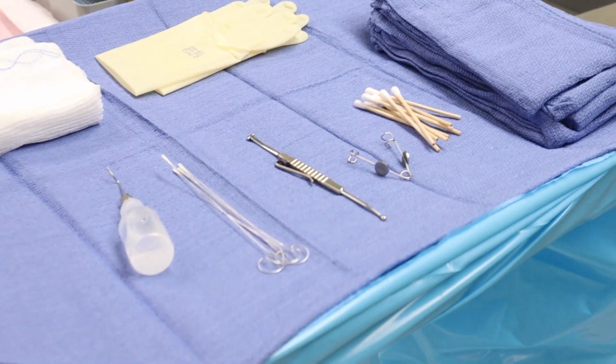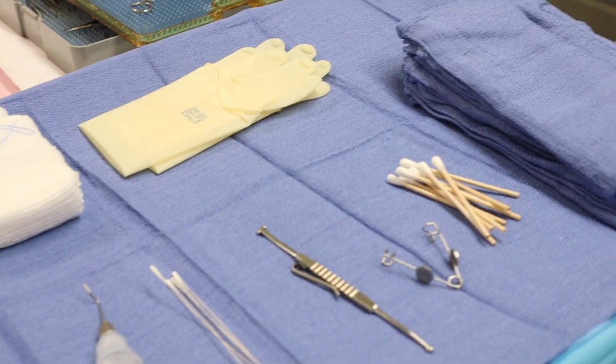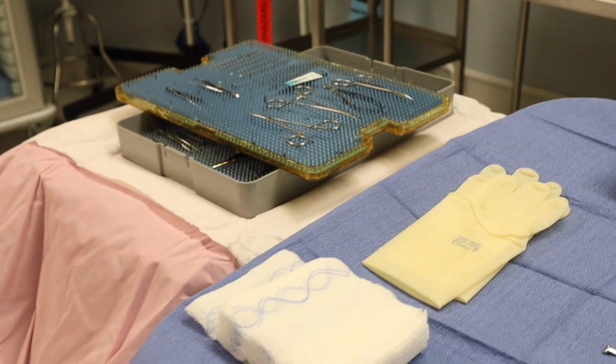Here's all the equipment. I love these. These are Calgi swabs. That's what I use. I don't use that baby depressor. The lid speculum is fine. And then you don't really use anything else.